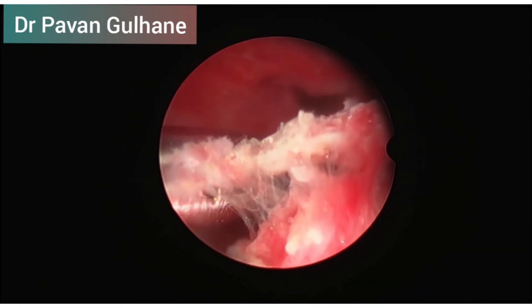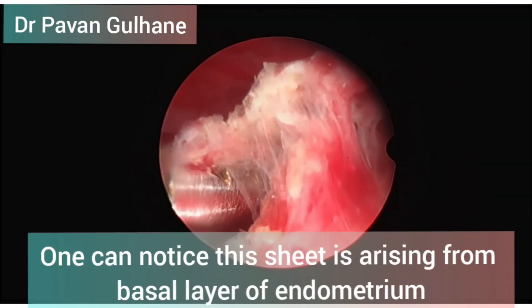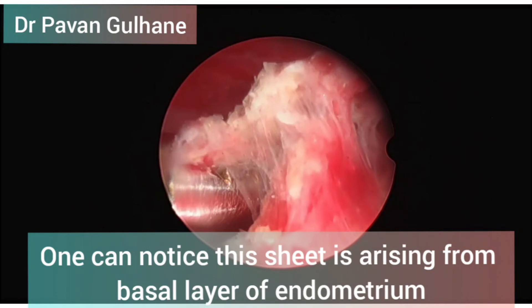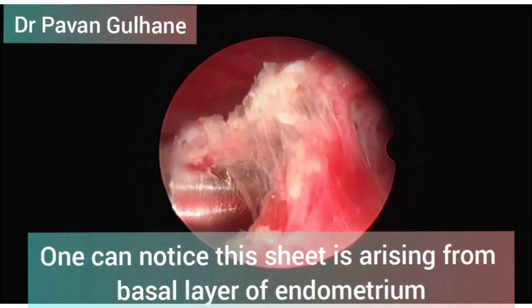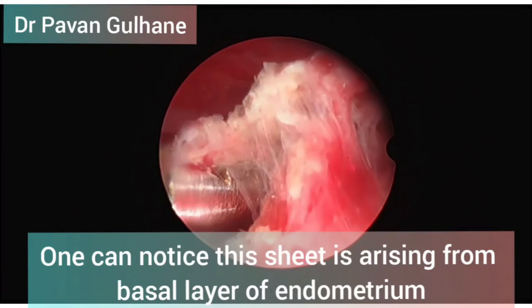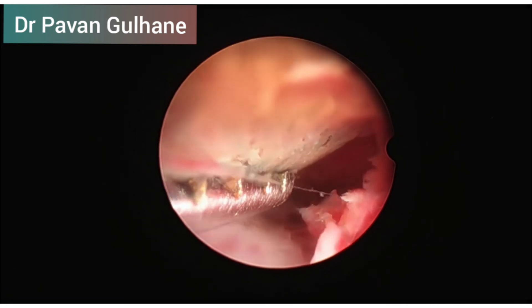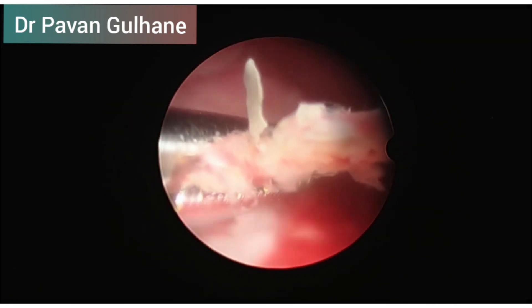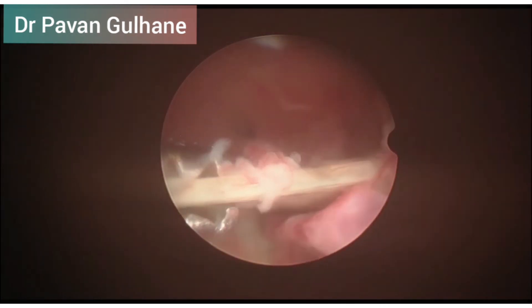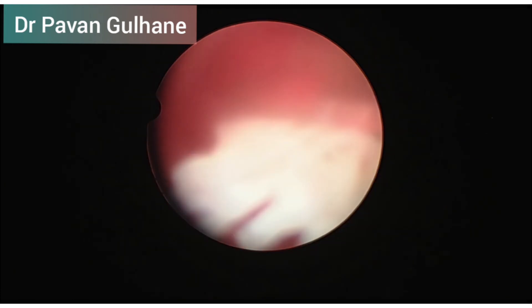Here, during removal of the bony piece, you can notice this tissue is arising from the basal layer of the endometrium. That means this transformation happens at the level of the basal endometrium due to chronic irritation on this tissue. While doing the procedure we have to make sure that we remove even the smallest piece of bony tissue out of the uterine cavity to give the best result to the patient.